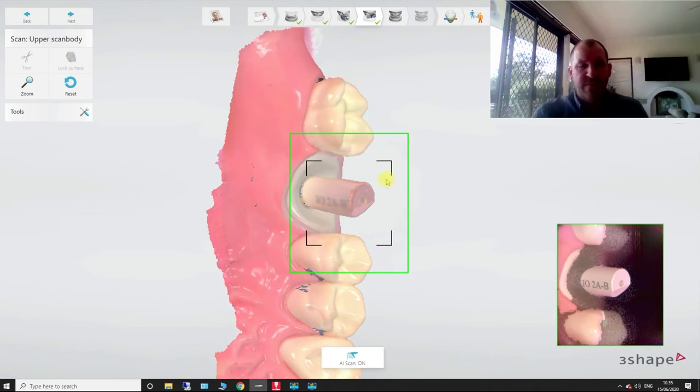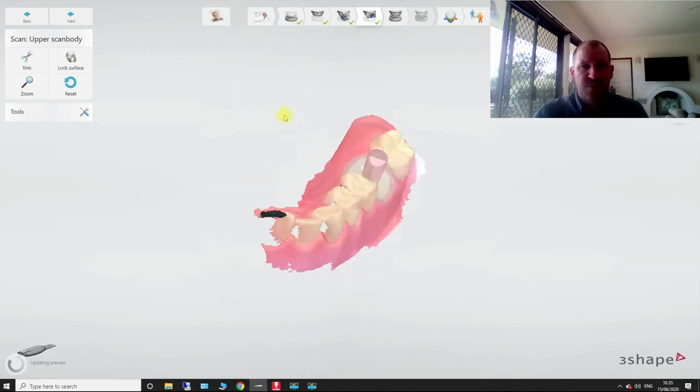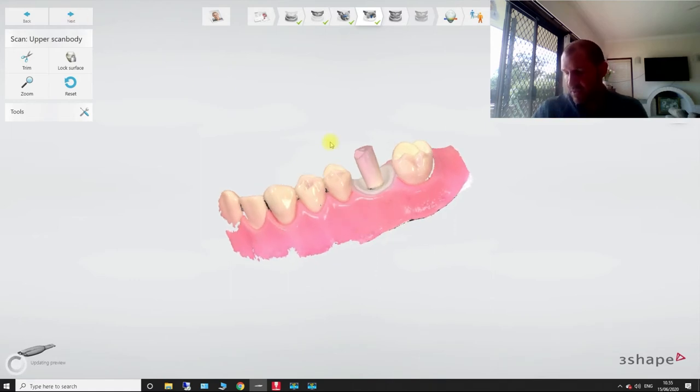And then now we're just going to scan that in. So that's our scan body scanned in. So we're all good to go now.